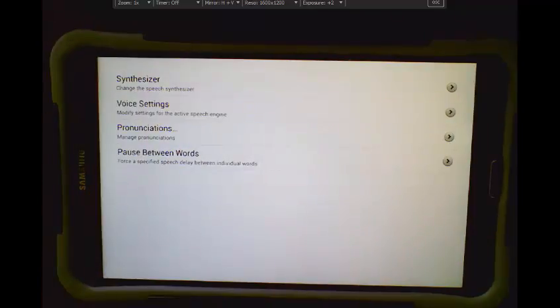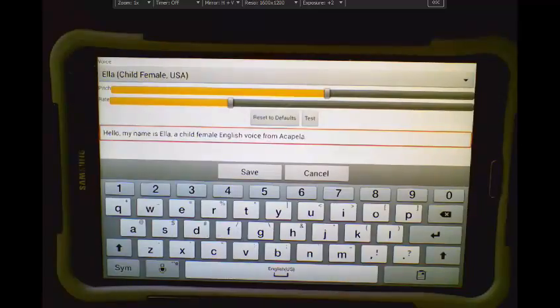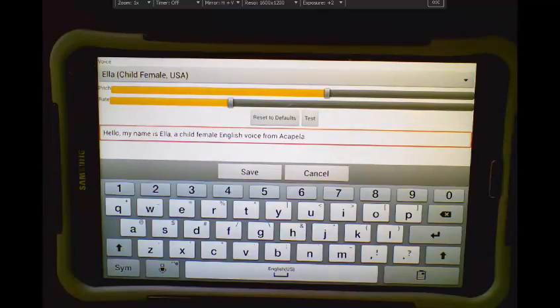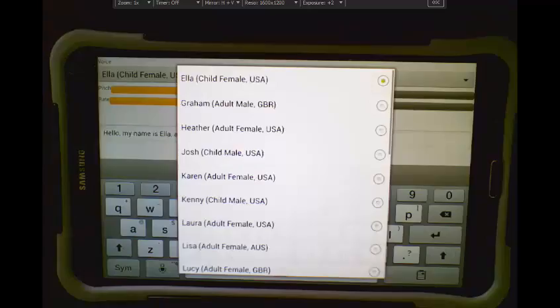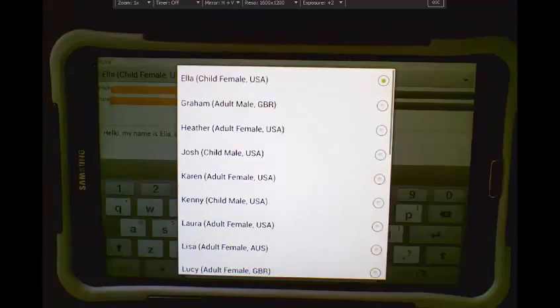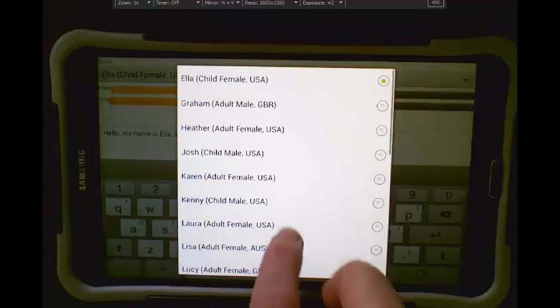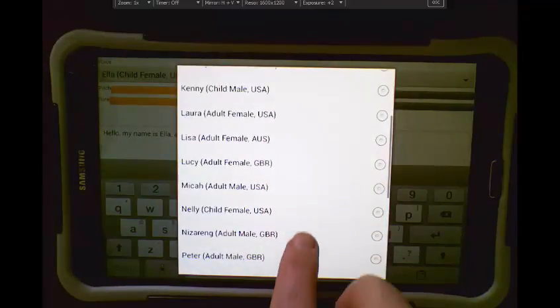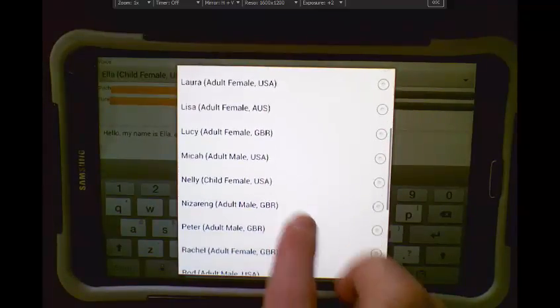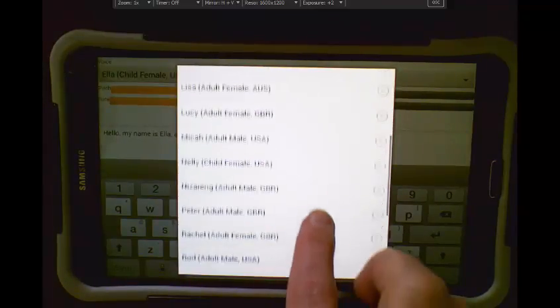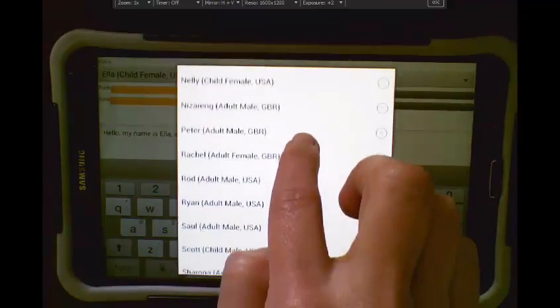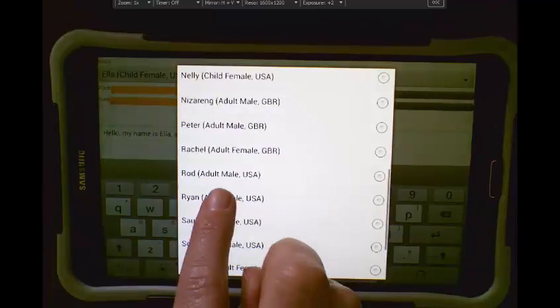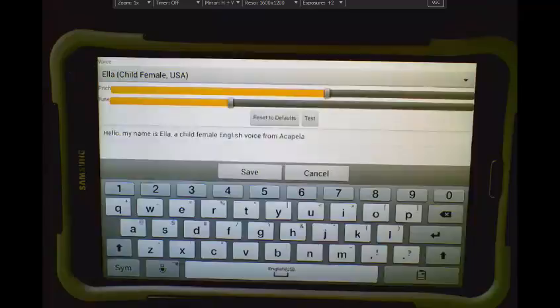and I can see that my voice has come up. You'll see that there are two bars there, one for Pitch and one for Rate. I'm going to select an adult voice. So I'll select Ryan.